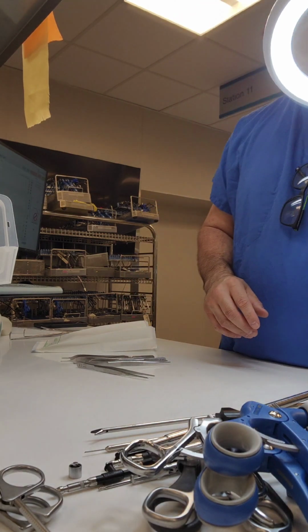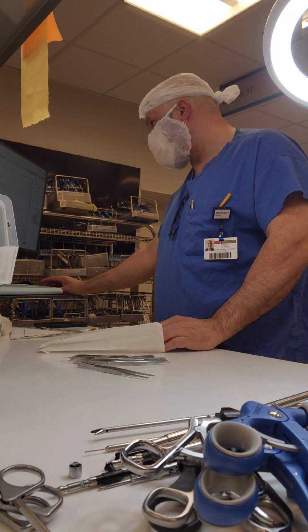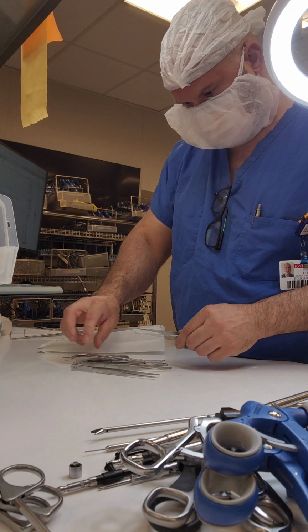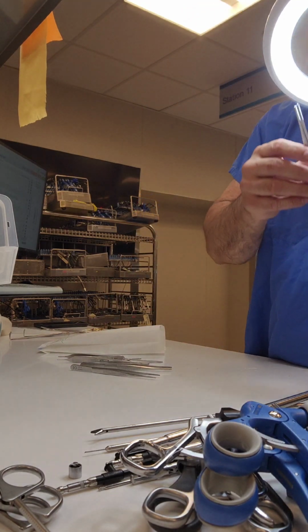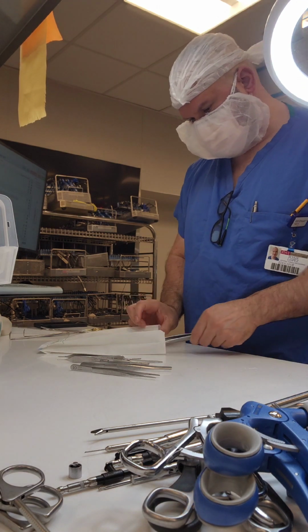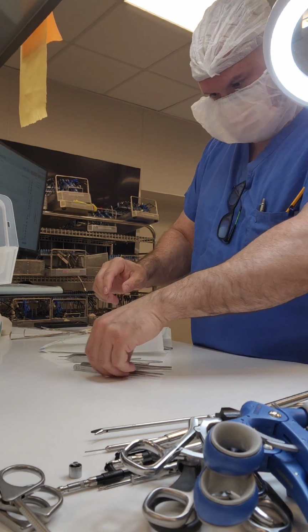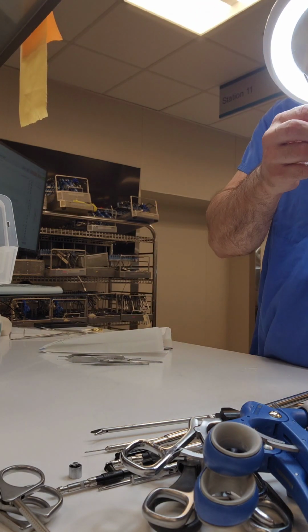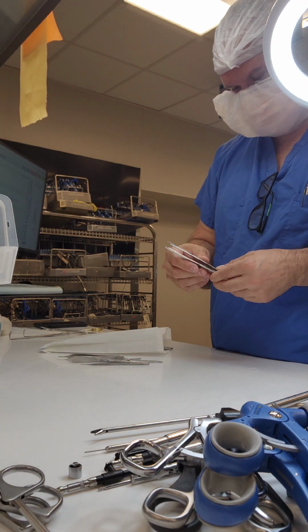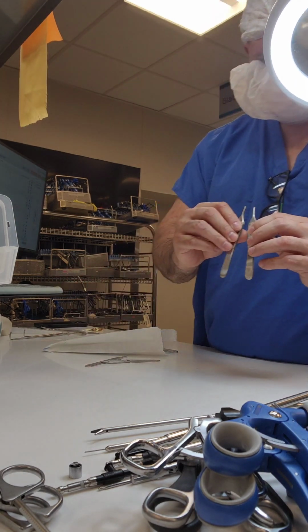Looking at my forceps, making sure that the tips close and align, that there's no bioburden on the jaws or in the little section where the forceps meet, the weld area of it. Okay, next forceps that I need, doing the same thing. Again, utilizing that lighted magnification. Because again, we can see most things with the naked eye, but smaller instances, especially with like Adson tooths and those fine tip forceps, you definitely want to utilize that lighted magnification. And as you can tell, that lighted magnification is a lot better than the illumination on the table itself. Okay.